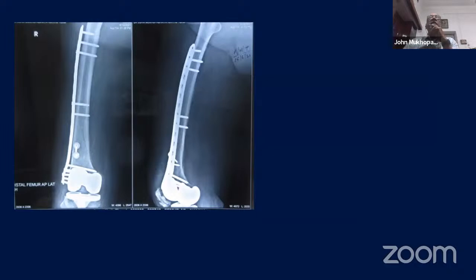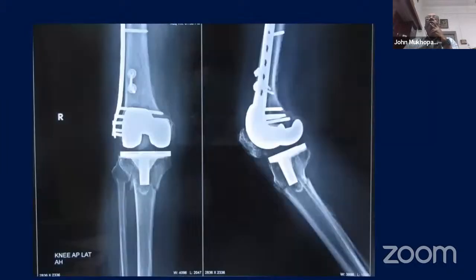This is another interesting case who earlier had a femur fracture which was fixed after a knee replacement and then developed a total fracture of the tibia. So here you can see it's a complete fracture. It's displaced a bit. You can see the angulation. And in this situation, you have no option but to go ahead and fix it. And you need to get a good stable fixation.